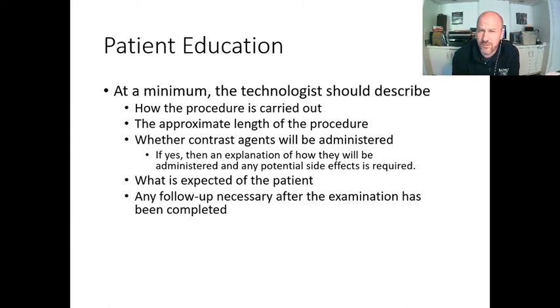You don't need to tell the patient that, but you do need to educate them on the fact that you need their cooperation, that they're part of a team with you in getting the procedure done effectively, and making sure that you reduce any anxieties that they may have. In terms of avoiding killing them, that's why you get paid the big bucks.